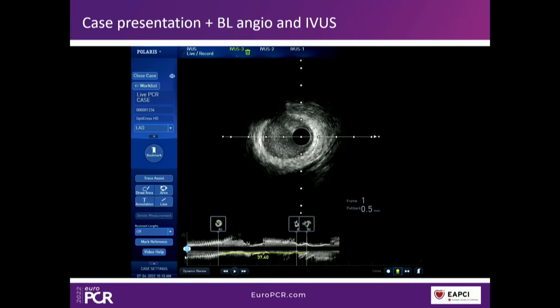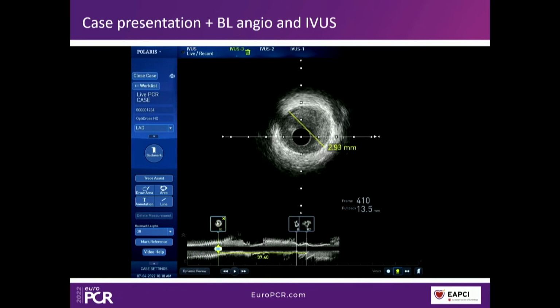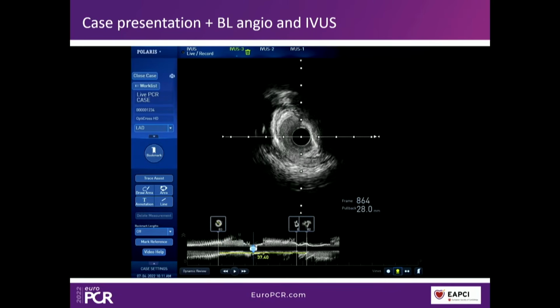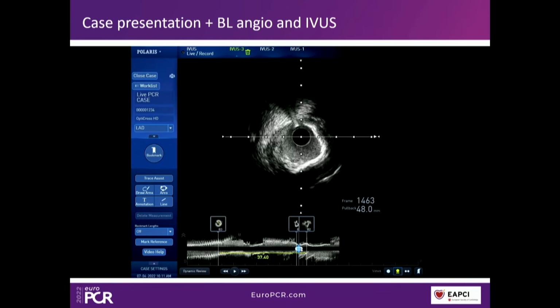Okay, so James has just done some pre-dilatation of the LAD with a 2.5 mm non-compliant balloon, and we were able to pass the IVUS catheter more distally now, and we can see that there is a nice normal disease-free landing zone distal to the diagonal with external elastic lamina measurements of about 3 millimetres. So that's looking like a nice distal landing zone. We can see, again, this area of concentric calcium here is disrupted. And coming up to that very tight proximal lesion, we can see actually there is a bit of disruption already just with the non-compliant balloon, but it probably needs some further calcium modification there.